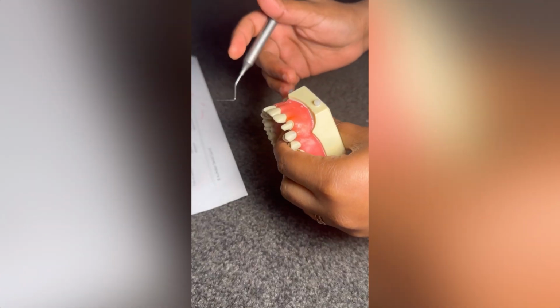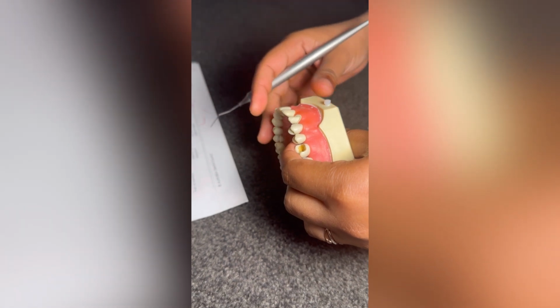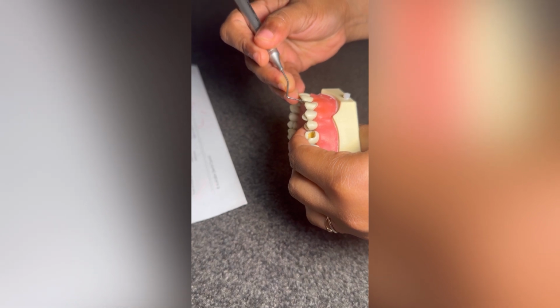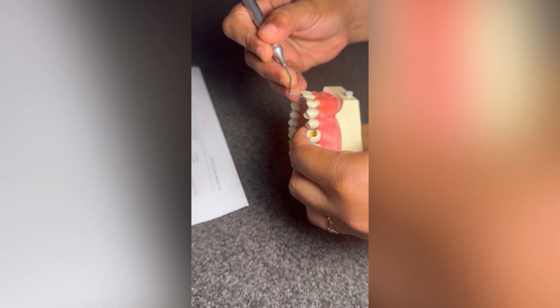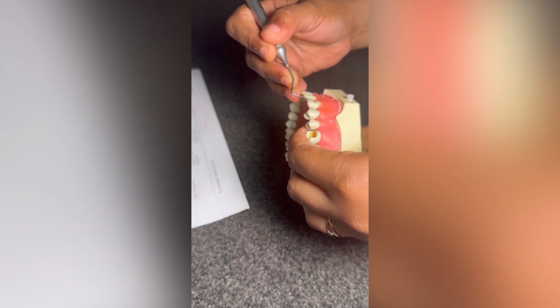The first criteria is the margin position, and margin is 0.5 millimeters supragingival. So let's have a look. Facially it is less than 1 millimeter, I would say. Maybe a little bit of equigingival here.